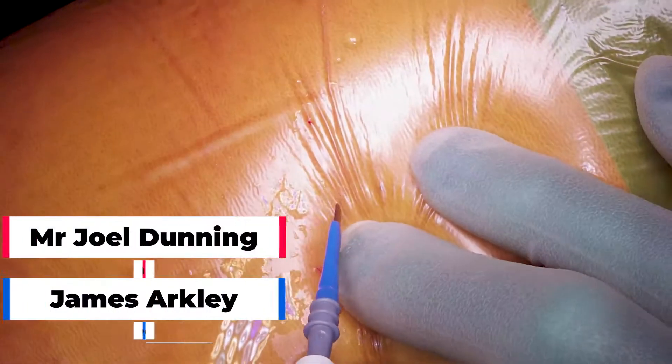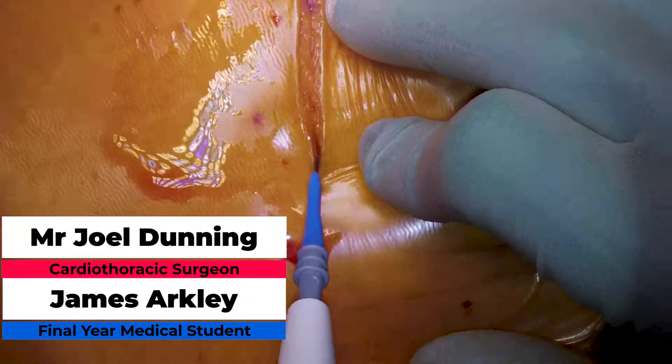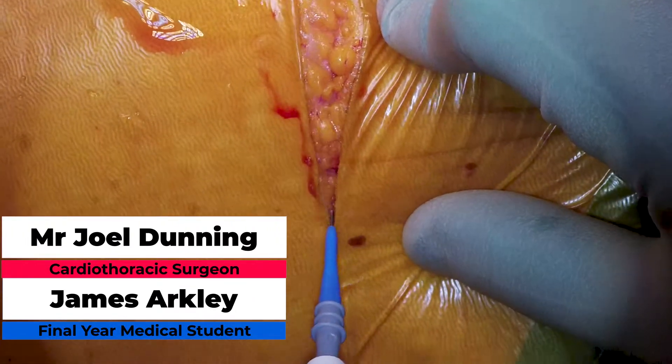This is part one of a two-part video series covering an upper lobectomy for a lung cancer case. The case was performed by Mr. Joel Dunning as chief surgeon. I'm James Ackley, a final year medical student, and I was assisting.